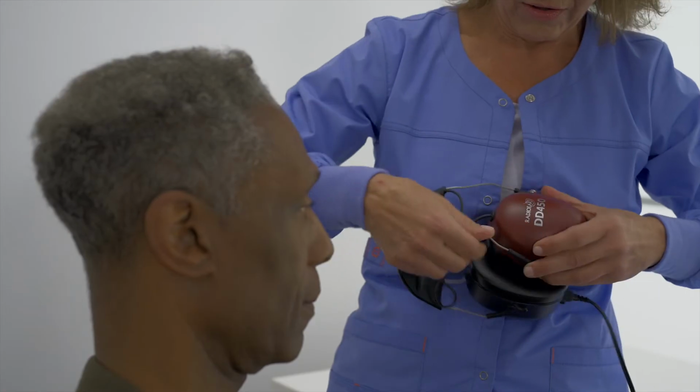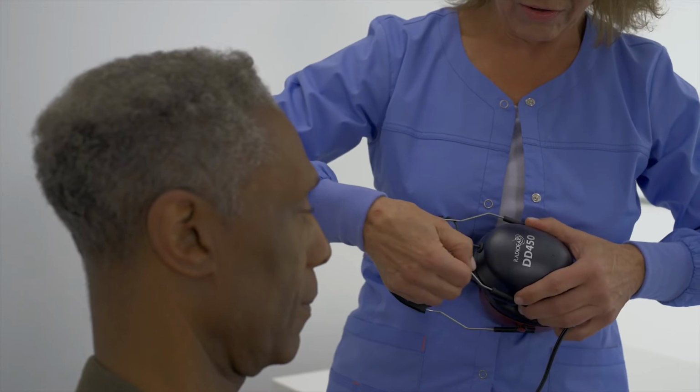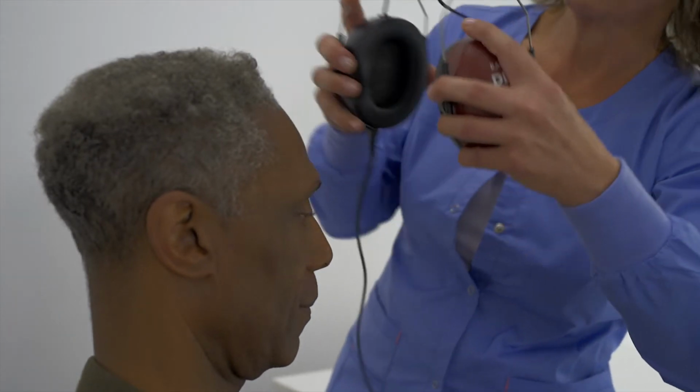Make sure both ears are within the center part of each ear cup. Make sure the red headphone labeled R is over the right ear and the blue headphone labeled L is over the left ear. If adjustments are needed, remove the headphones and adjust the headband for a secure fit.